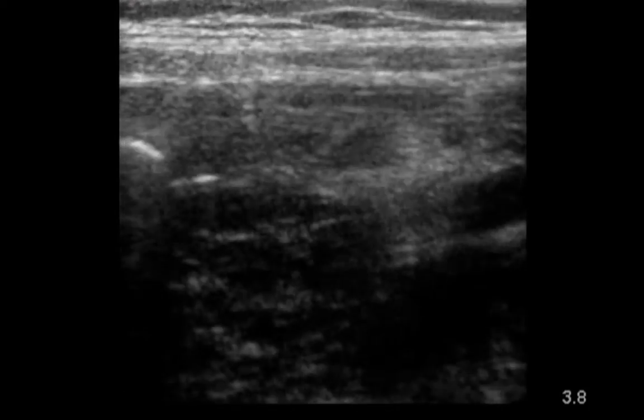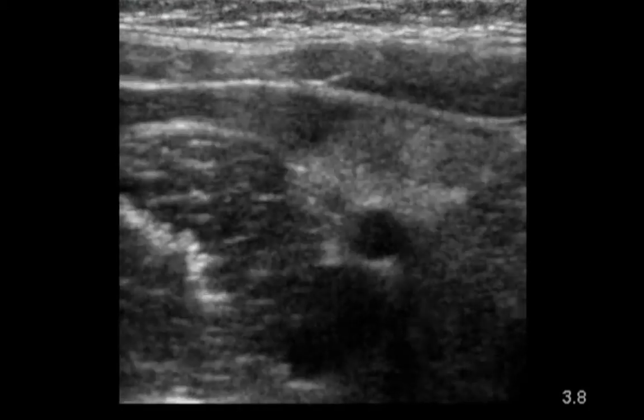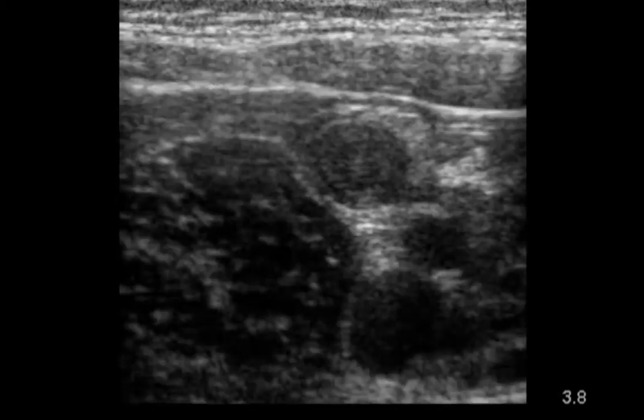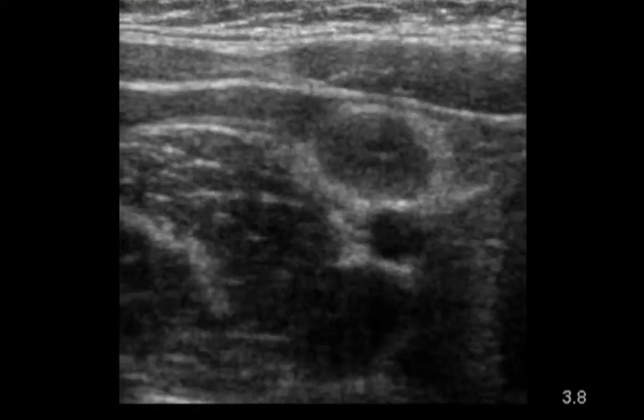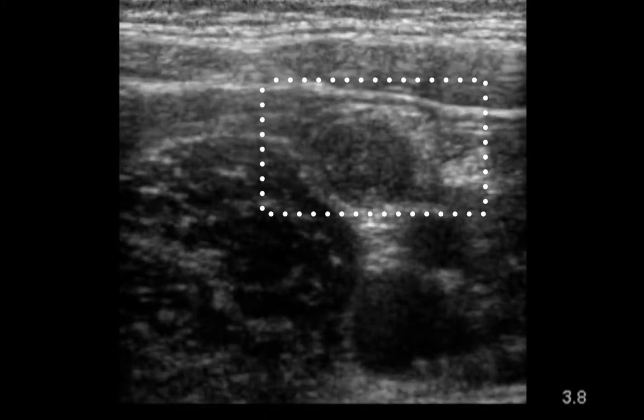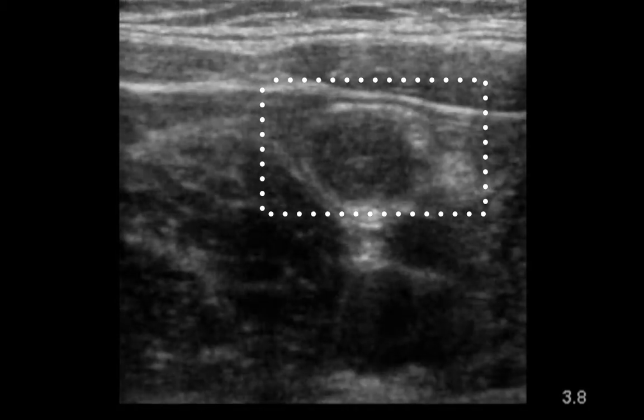If the patient has pain in the right lower quadrant and you can't easily identify your appendix right away, you can just go around about that area to find your appendix. And so, as we just talked about, it should be in that area here.